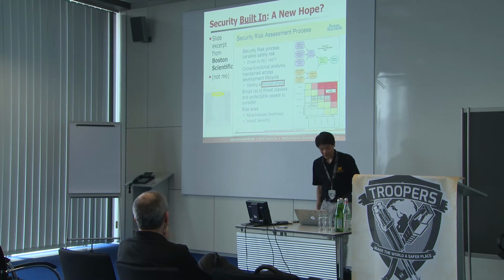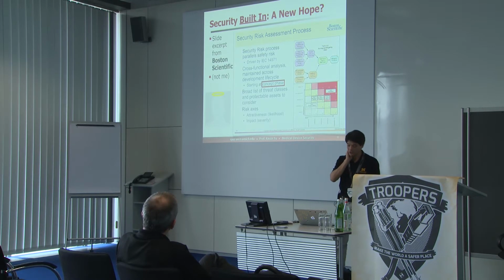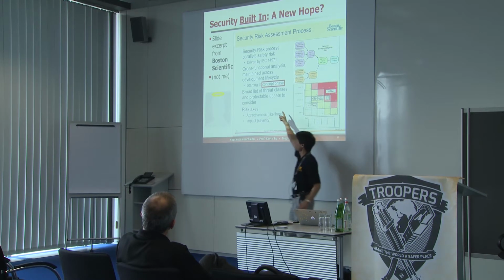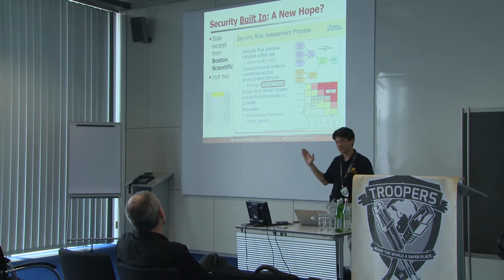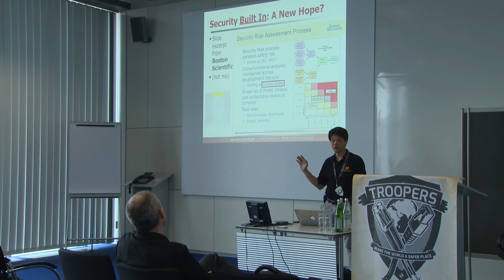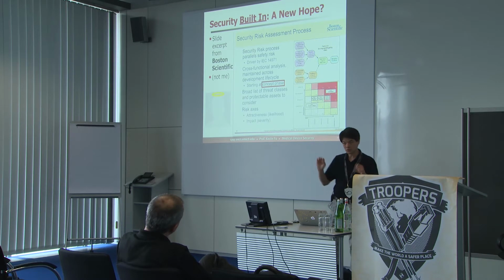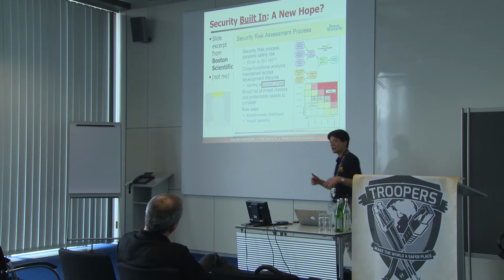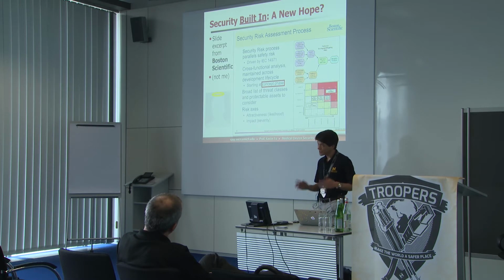And out at Boston Scientific, also a leading manufacturer of cardiac implants, among other things, they actually think about security in what they call the concept phase. This is radical thinking, okay? So the concept phase means the whiteboard, okay? This is the whiteboard before you've even written the requirements document for what your device does. So it's good news to hear that security is making its way into the beginning, because of the old refrain: you can't bolt security on after the fact, you need to build it in. They are actually trying to build it in. Not every manufacturer is doing this, but some of the manufacturers who are a little more clueful are doing so.